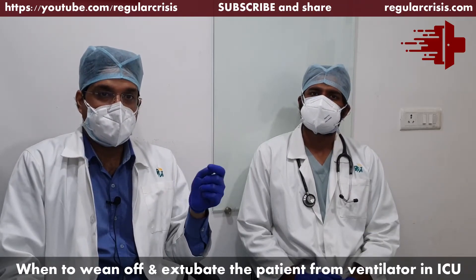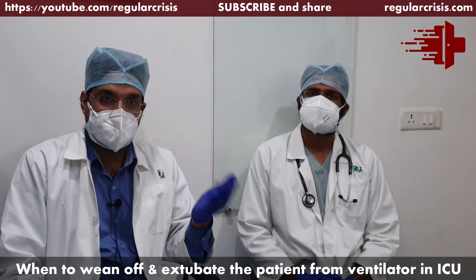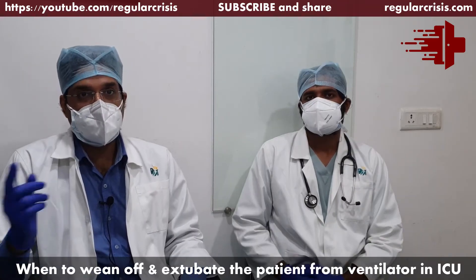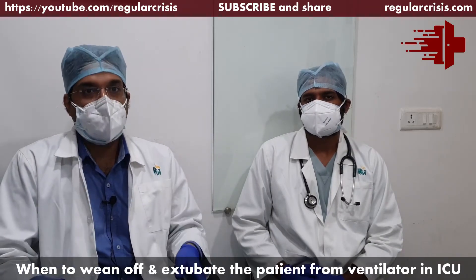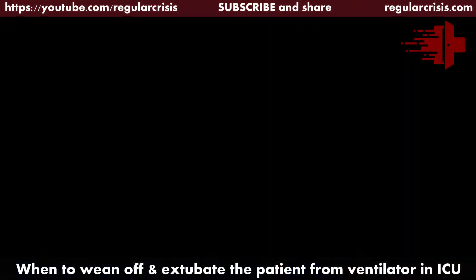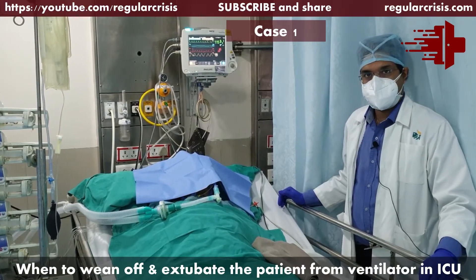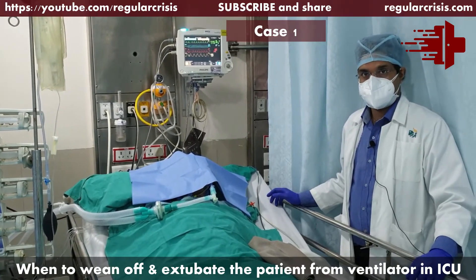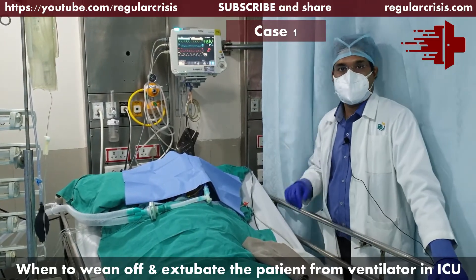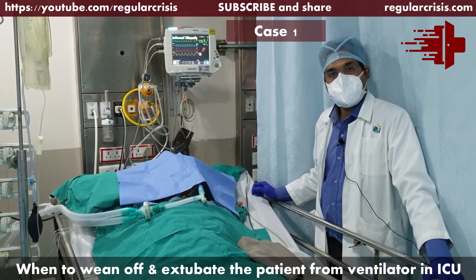So next time someone asks you whether to wean off a patient, follow these six steps and you will get the answer most of the time. Now we will go to the patient bedside and try to apply the six steps. This is case number one. The primary pathology: this patient was admitted because of cardiogenic shock and pulmonary edema. She was not able to maintain on NIV and also had AKI not responding to diuretics, so we ventilated her.